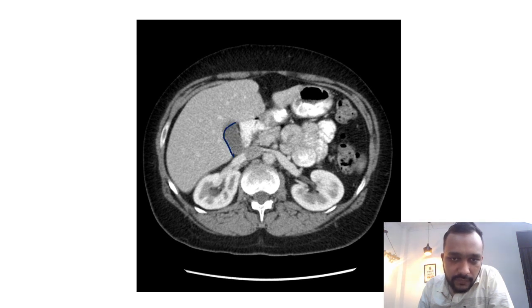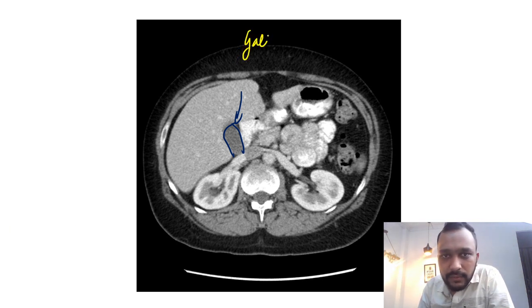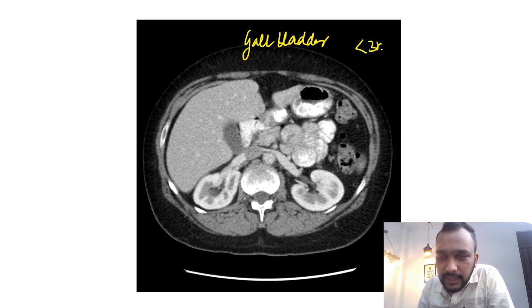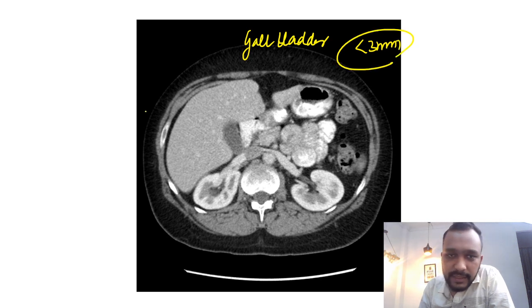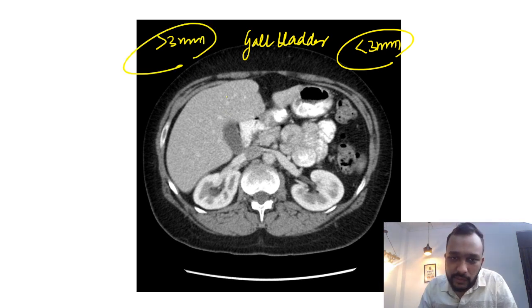If we go down a few sections lower, we can see the gallbladder as well. I would like you to appreciate the wall thickness of the gallbladder. You will see that the wall thickness is negligible — it is less than 3 mm. I'm going to show you one case in which the wall thickness will be more than 3 mm.